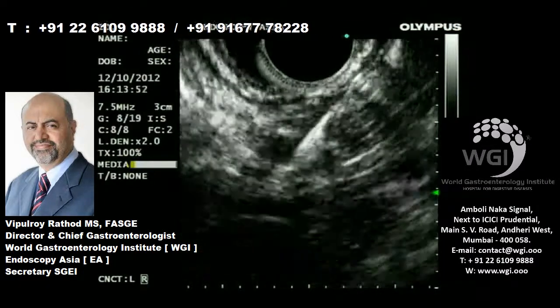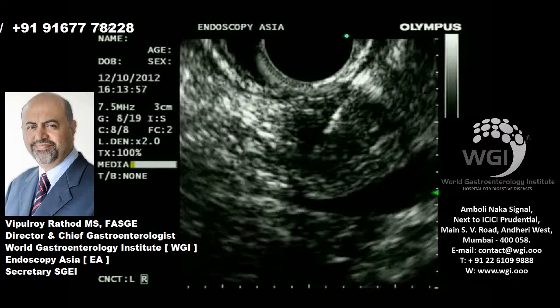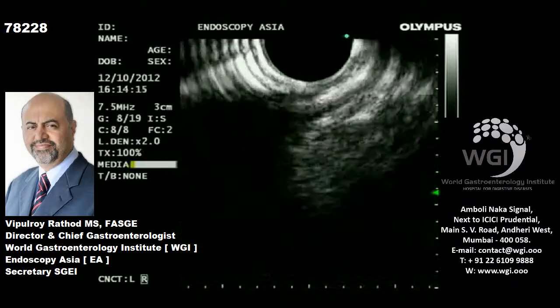Now we can debate whether this FNA should be done, but this was purely done on the insistence of the patient and the referring clinician.